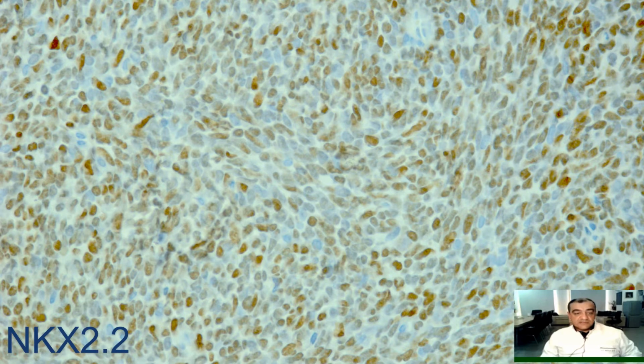visualized by immunohistochemistry. So it is a very characteristic positive staining for Ewing sarcoma, although again it must be mentioned that it is not completely specific for Ewing sarcoma, as it can be seen in other tumors also.